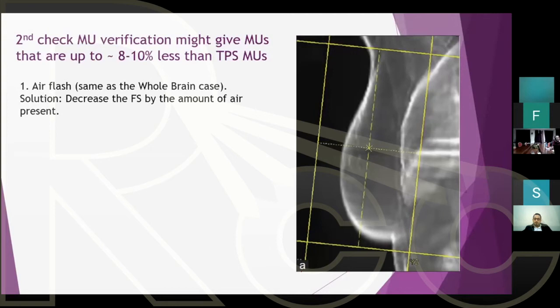Look, breast planning, when I second check a breast plan, I really take my sweet time because a lot of things can go wrong in a breast plan, and all of our brains look the same. Well, maybe the shape is a little bit different here and there, but the breast changes from one patient to the other, and it could change for the same patient during treatment. How she holds her hands up, how she holds her hands down, she's arcing her back, there is seroma, and so on. So yeah, you have to pay attention for breast.